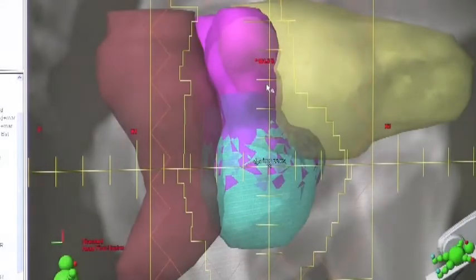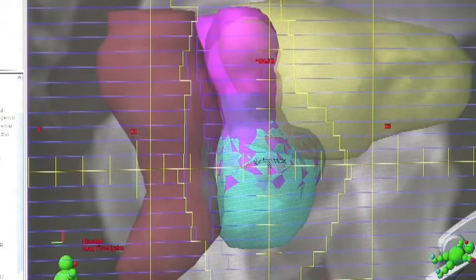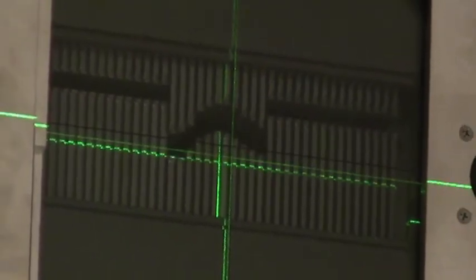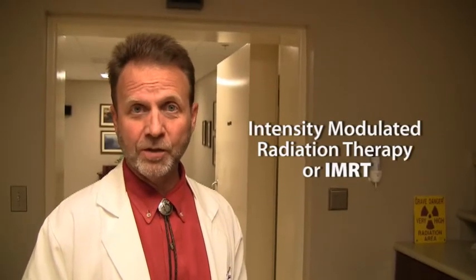Now we are able to, on the computer, draw what we want as far as a shaped field and then create that in the machine with these interlocking leaves. The leaves are actually rather thick — about this thick. Each patient is treated in such a way that these leaves change in between the fields that are treated. There are specialized techniques where, while the machine is on and treatment is being given, the leaves may move at the time of treatment. This approach is called intensity modulated radiation therapy.